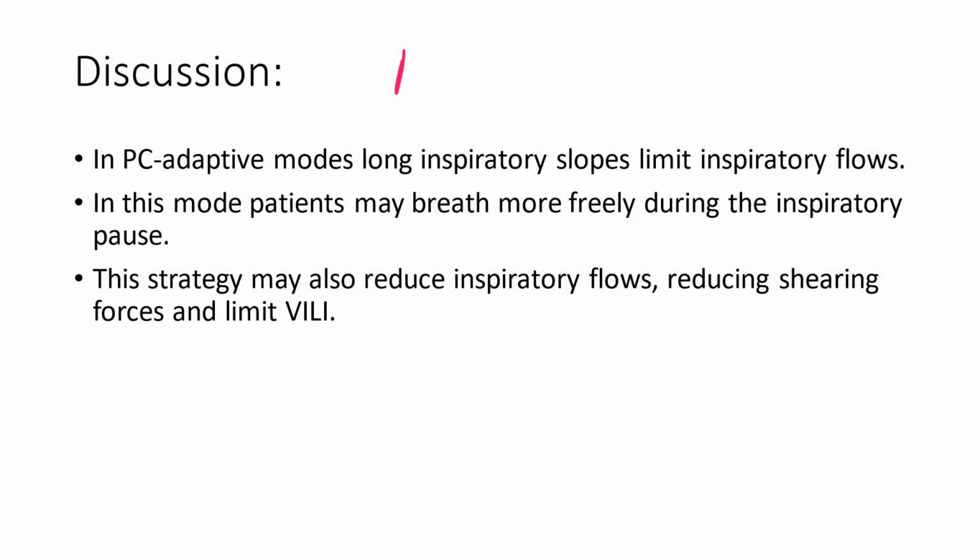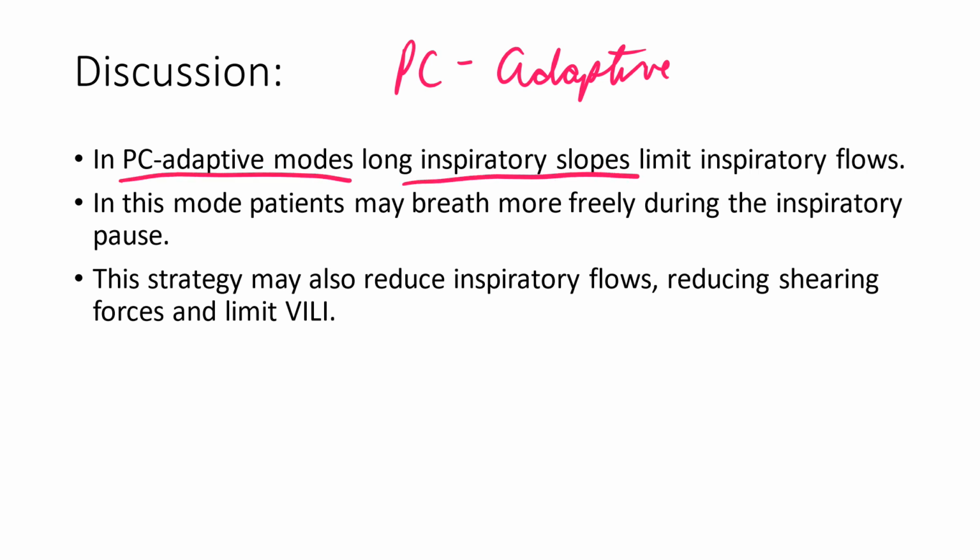So using PC adaptive is a very good mode because it gives us our volume targets. We still get that long inspiratory time. And in PC adaptive modes, we can control that peak inspiratory flow by controlling the inspiratory slopes, or by inducing, it depends on the type of ventilator, they call it different things, a little bit of inspiratory resistance, we can modulate that inspiratory flow to limit that, so we can potentially decrease shearing forces.